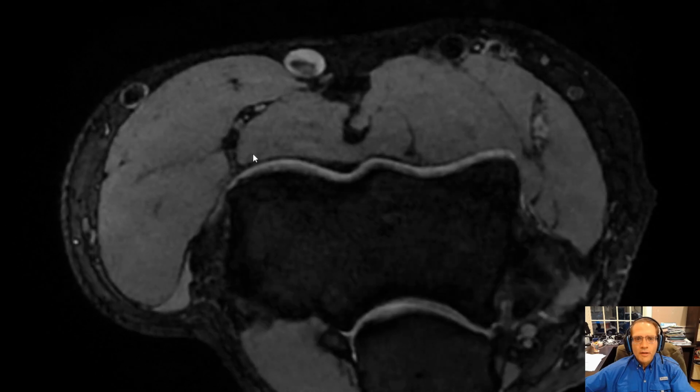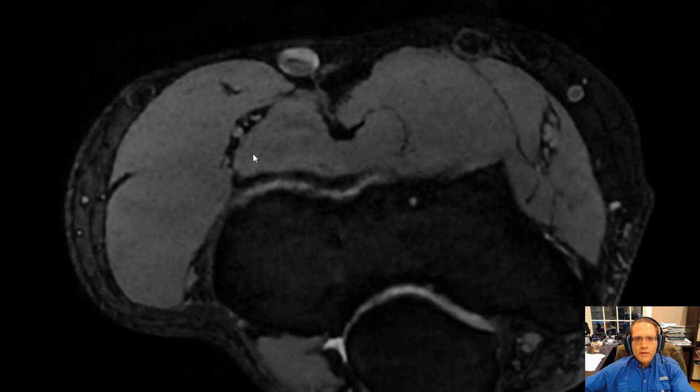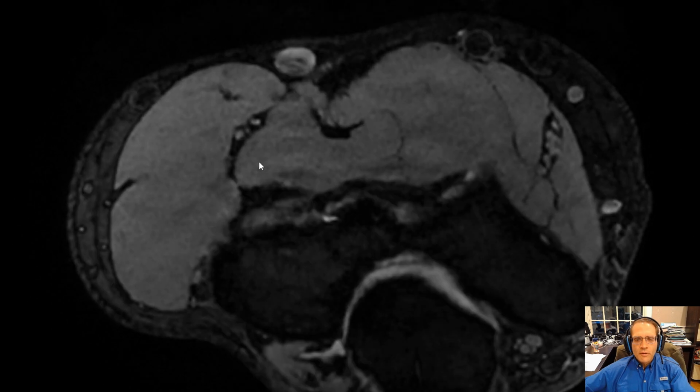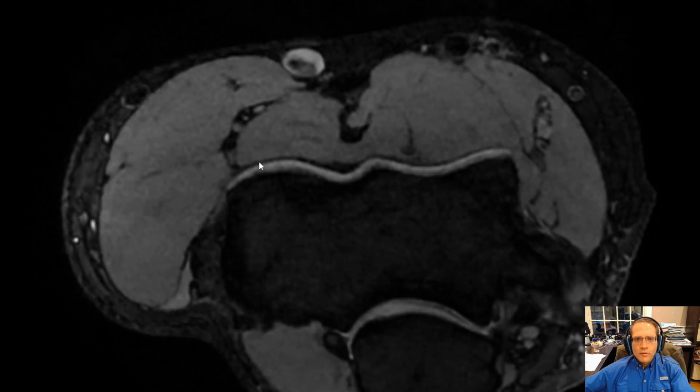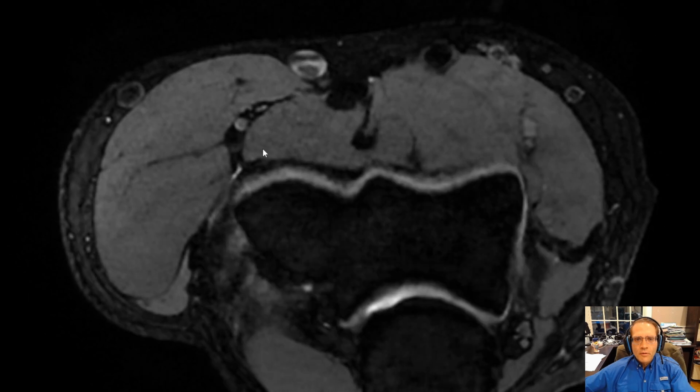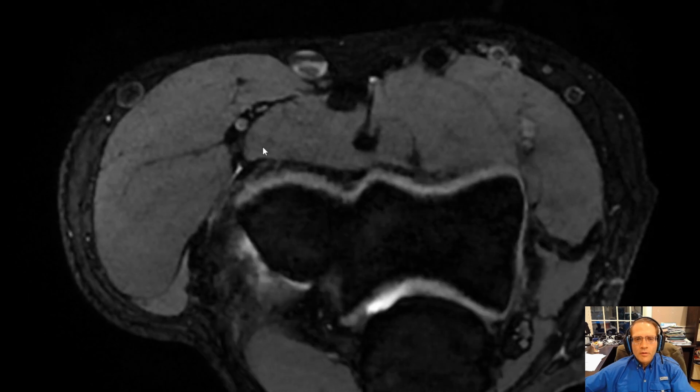So I'll roll through that again, constricts down, dilates back up. So here I am proximally. So roll through, constricts down, boom, and dilates back up. That's the second point of constriction. So two separate points of constriction along the radial nerve.